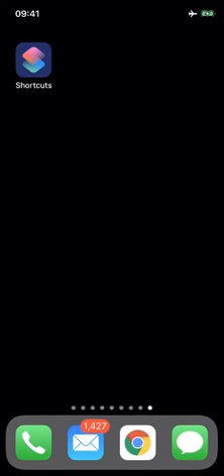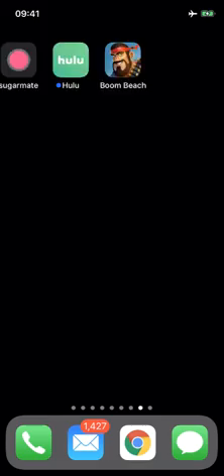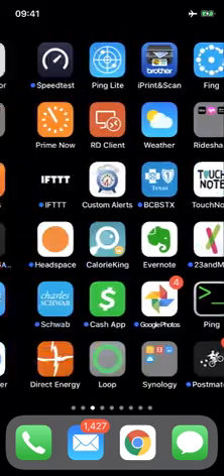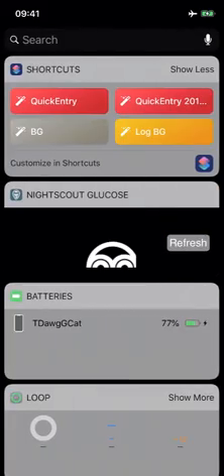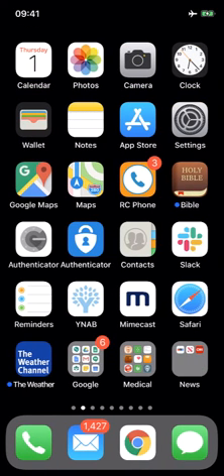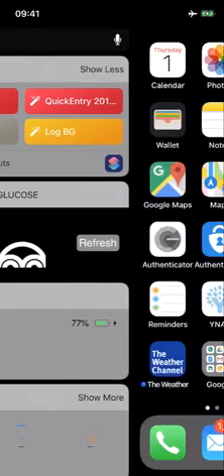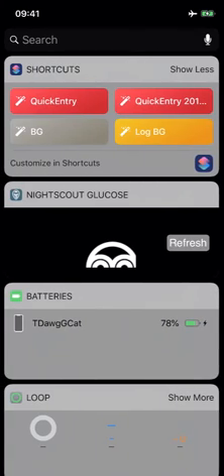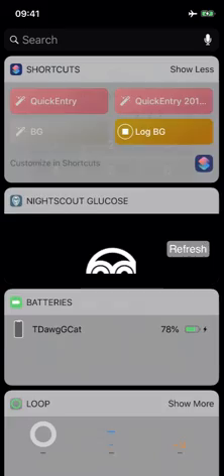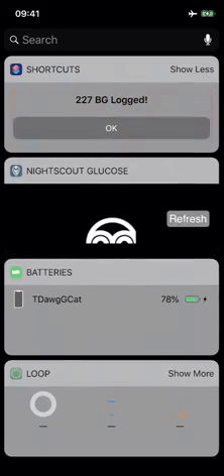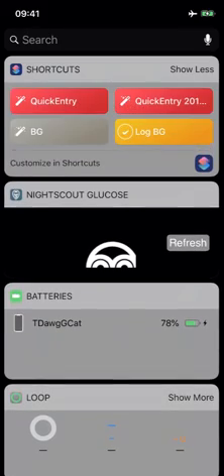Now the widget, because I have shortcuts on my widget screen on the far left, there's my new yellow button. So you can imagine if you want to log in and you're on your home screen, you can just swipe left, hit log BG. I'm at 227. Okay. And I'm done.